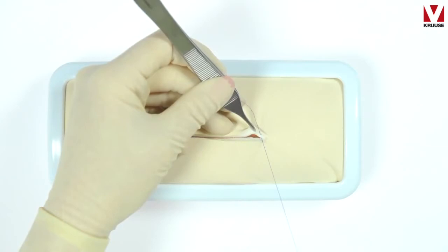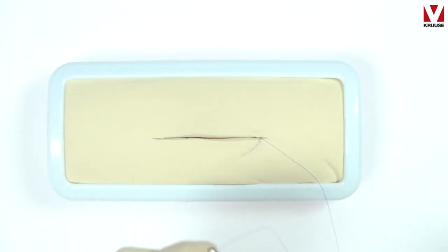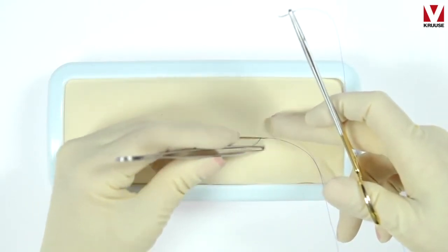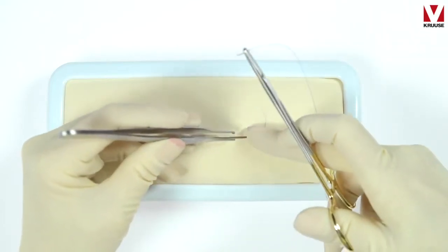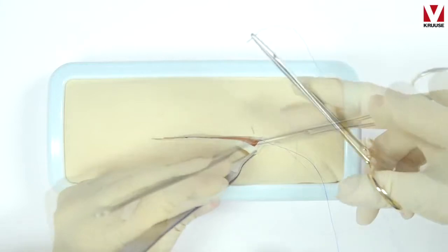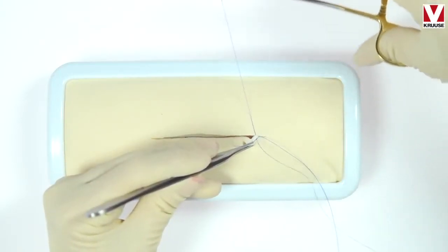Here you see I start superficial and then I go deep, take a bite of the subcuticular layer, and then I go superficial to deep once again on the opposite side of the incision.